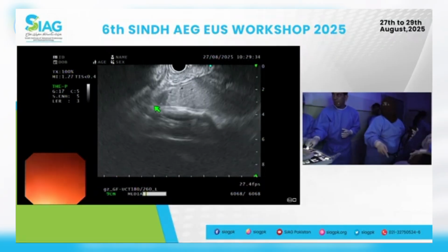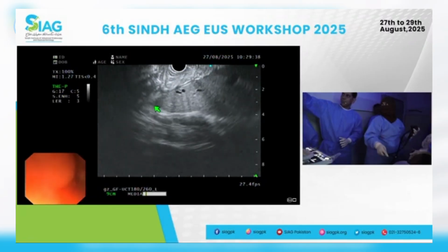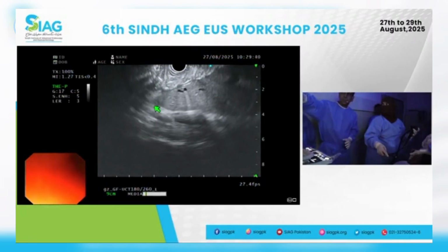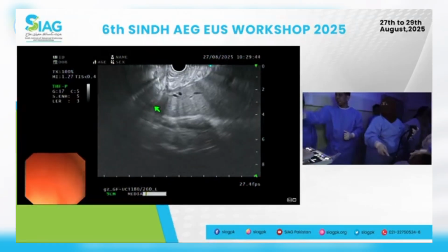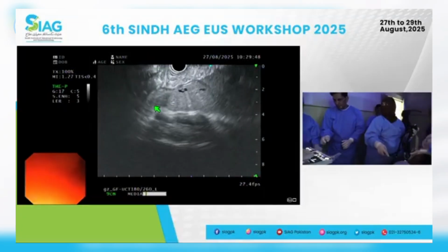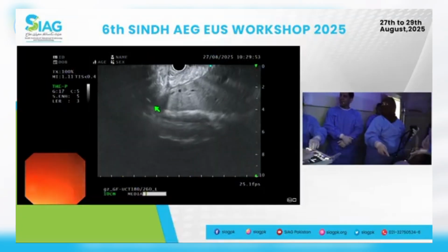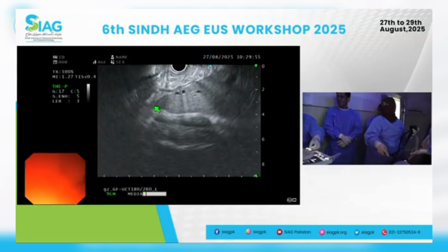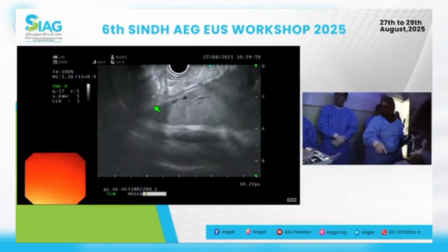Unfreeze it, please. Good. Okay. Now, the second thing: see that it's going from 0 to 8, and this part of the screen is of no use to us. Correct, exactly. So reduce it to maybe 4 centimeters. Reduce the depth, please. Reduce it. You are increasing it. A bit more. That's good. That's fine. Excellent. That doesn't look too bad.